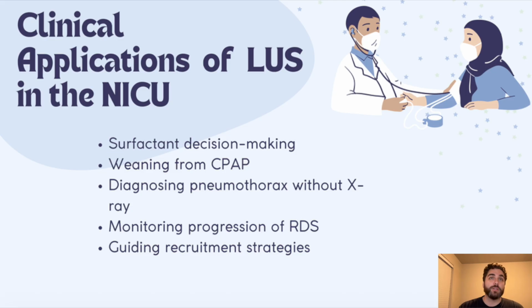The clinical value of lung ultrasounds extends far beyond just diagnostic purposes. It can also help clinicians with deciding when to administer surfactant, assessing the effectiveness of CPAP and looking for less areas of consolidation during the whole course of the baby being on CPAP, and also help determine when infants are ready to be weaned from the ventilator or from other respiratory support. Because, again, it's safe to repeat, this really becomes a great tool to monitor the progression and improvement of different types of lung diseases in real time, which is a huge strength.